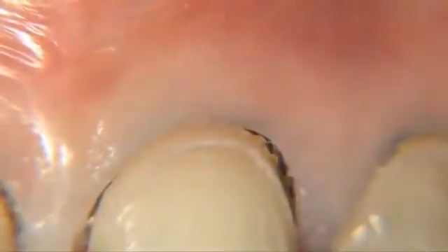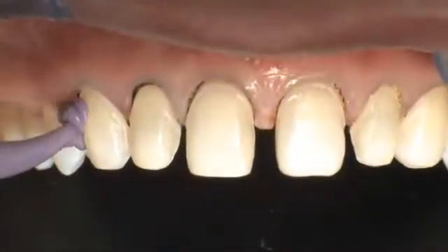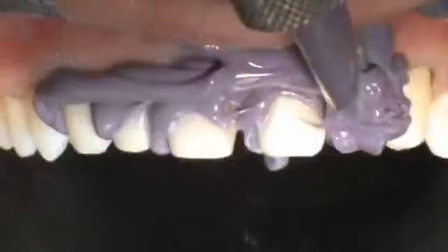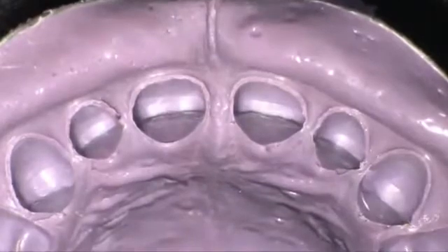After the second cord removal, an impression in polyvinyl siloxane was taken. It is important to visualize the impression to understand if the technician will be able to read clearly the finish line and the details of our preparation.